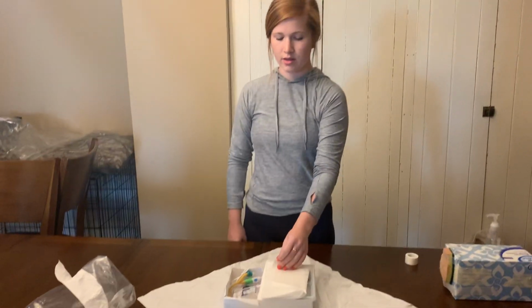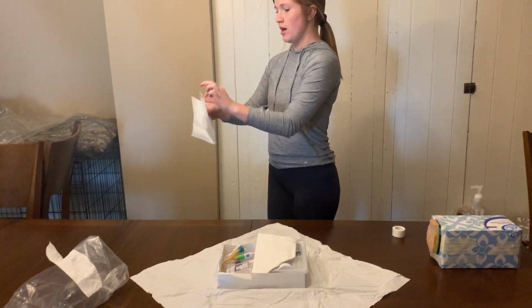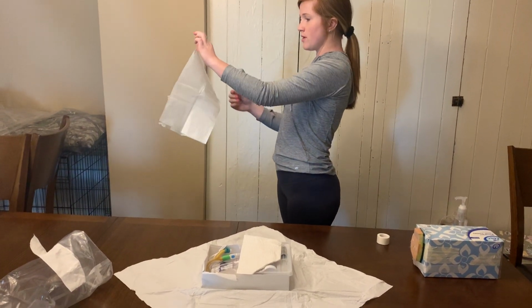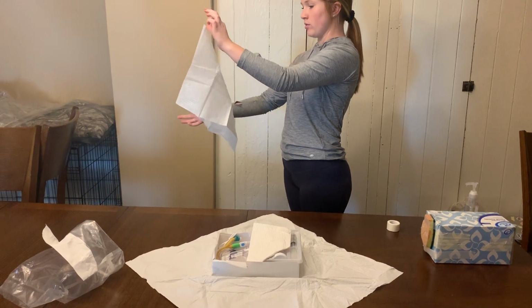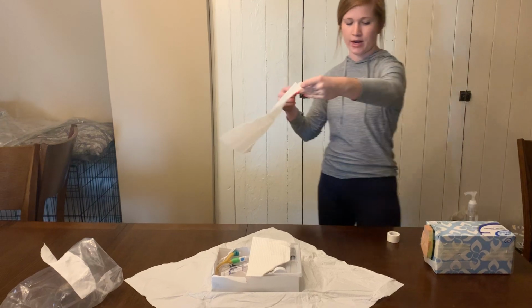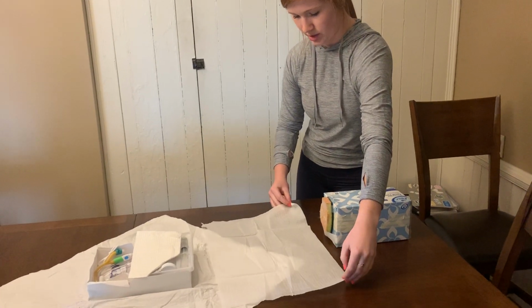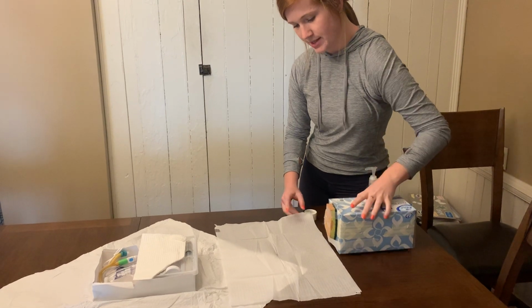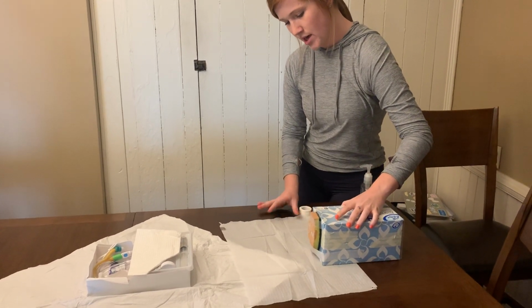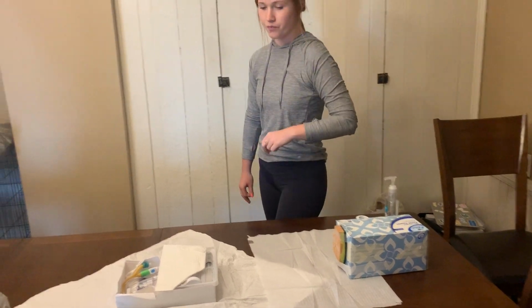The first thing we'll have to do is place this waterproof drape underneath the patient. I'm going to open it with the shiny side towards me because that's the side that will lay flat, and I'm just touching the outer 1-inch border to try to keep that sterile. Now it's going to be a little tricky crossing over my patient here, but I'm going to place this under what my patient's hips would be. In the clinical setting, it may be helpful to have another nurse help me do this.